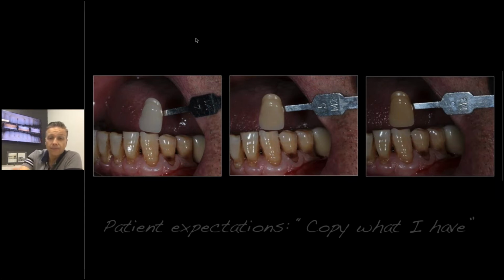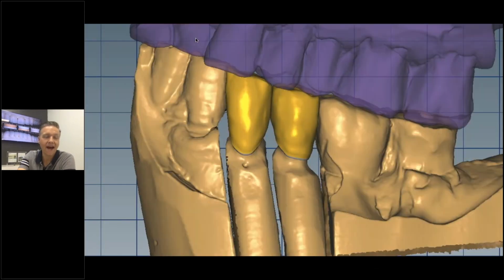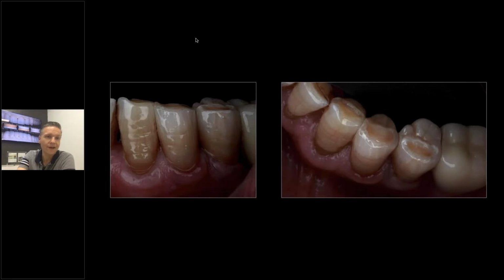The patient's expectations were just to copy what I have. So that was kind of where we're going from, and that's most likely the biggest challenge. Okay, let's copy that. And so we went through a design process in full contour and then milled it in Zolid FX, multi-layered, stained and glazed.